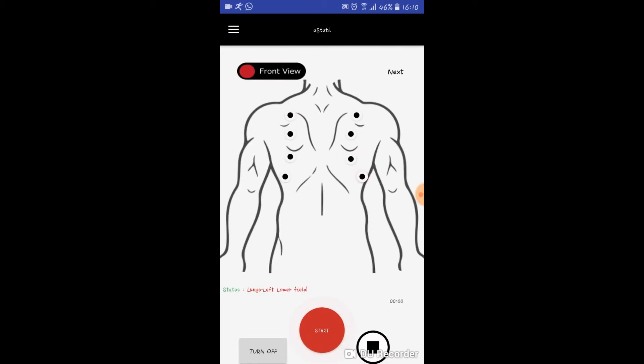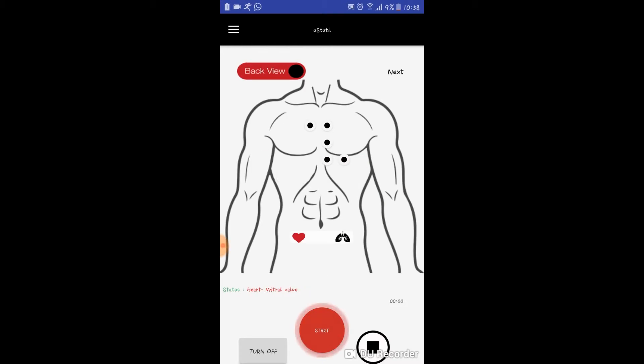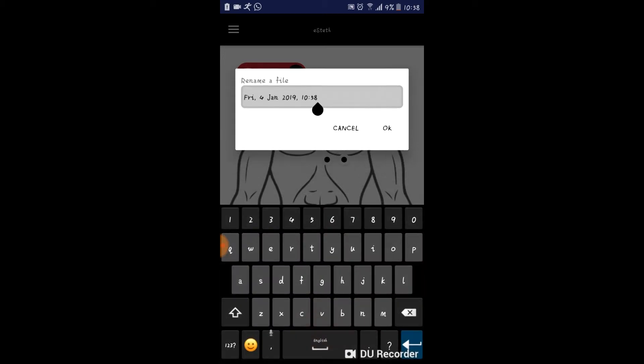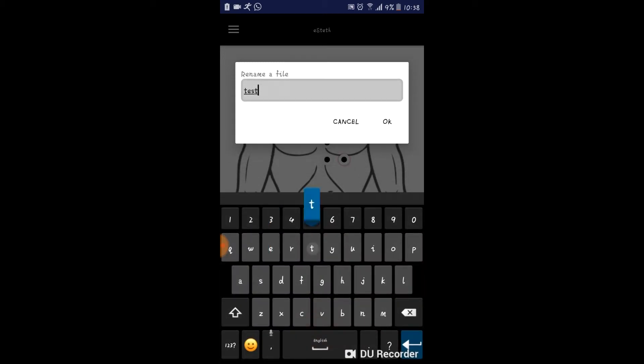The e-steth application offers you to record both heart and lung sounds. If you wish to record a heart or lung sound, you first have to rename the file and then start recording.